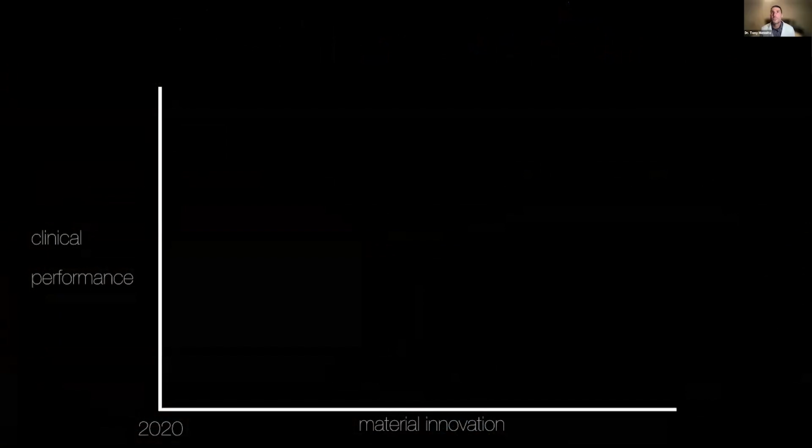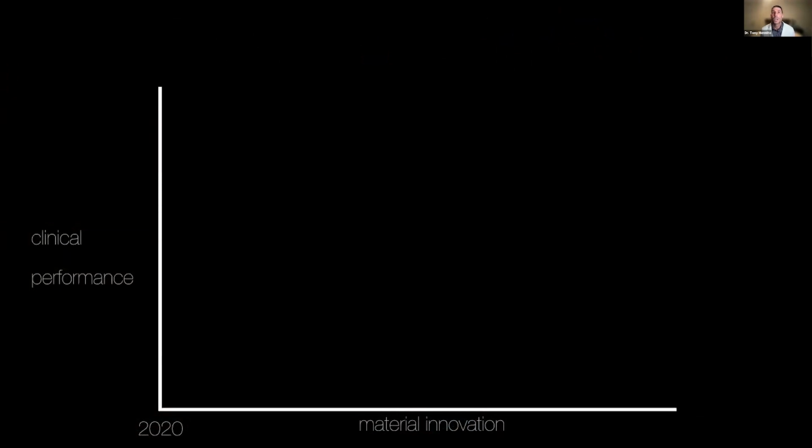So I would say I've done both. What I'm talking about here are a couple of cases where I've done 3D printed veneers that have been bonded to tooth structure. And then I have a few cases where I've done long-term provisionals that I have cemented on the teeth. So I think that's an important thing to know. But I've seen a tremendous amount of wear in both of these cases.